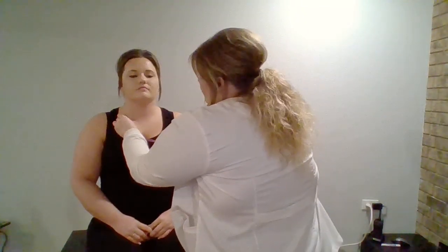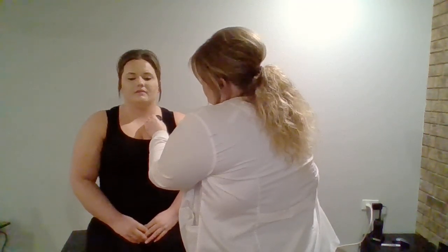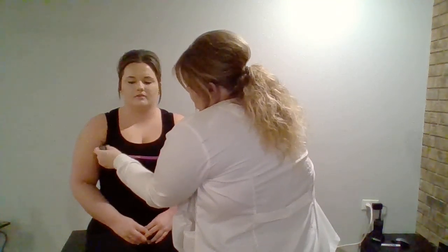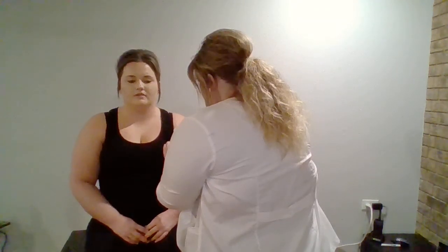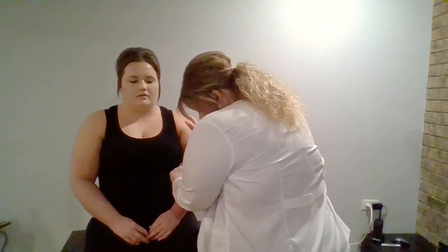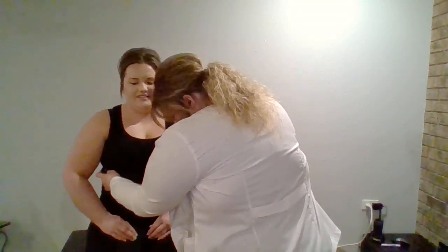And so while I'm here, I'm going to go ahead and really listen to her lungs really good. So it's going to be important for you to take some really good, deep breaths, okay? I'm going to listen in at least 6 spots all over. I'm going to start way up high at the apex. All right. Good job. Keep going. Okay, her lungs sounded good and clear throughout. I've heard all her lung fields on anterior chest really good. No adventitious breath sounds heard.